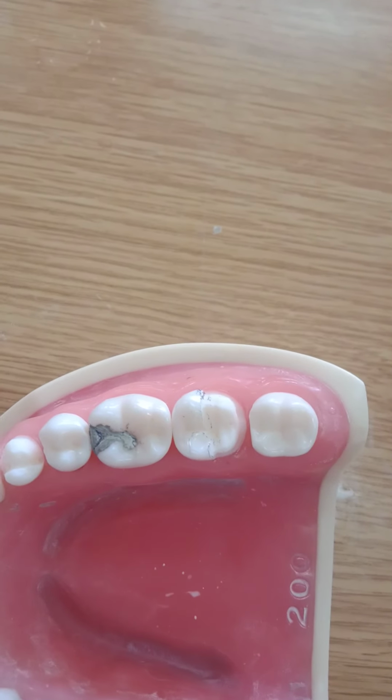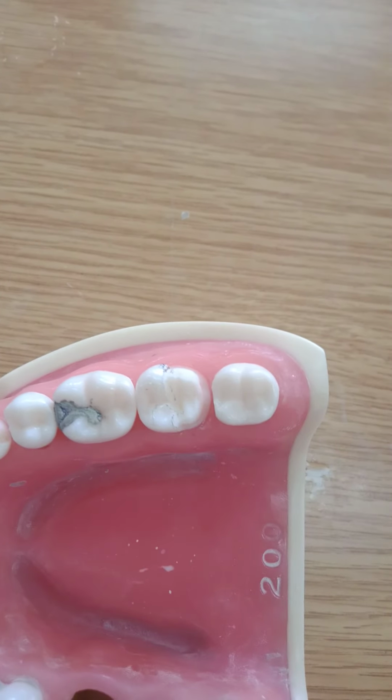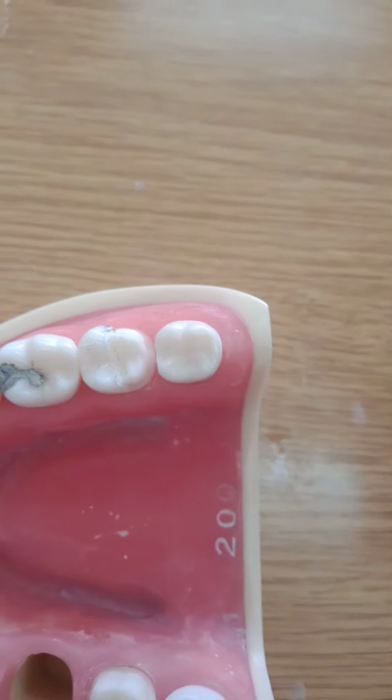So you have undercuts. Try to manage the undercuts, but without creating a lot of taper. Partial coverage crowns are as parallel as possible, not tapered.